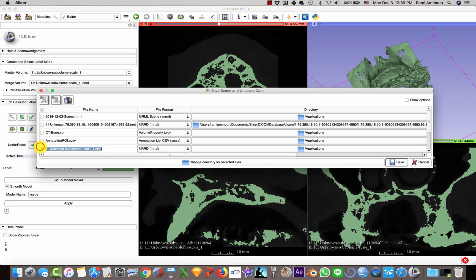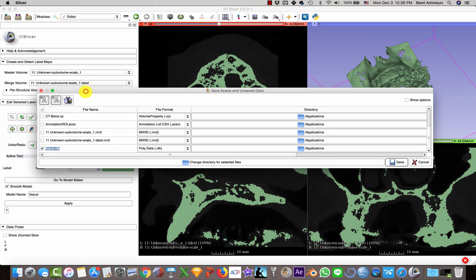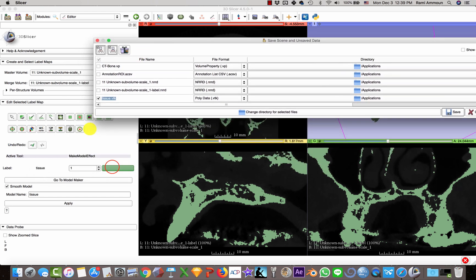It's named tissue here because of the preset. I should have changed it, however it's not a big deal. I just name this as bone model, then I select STL format.